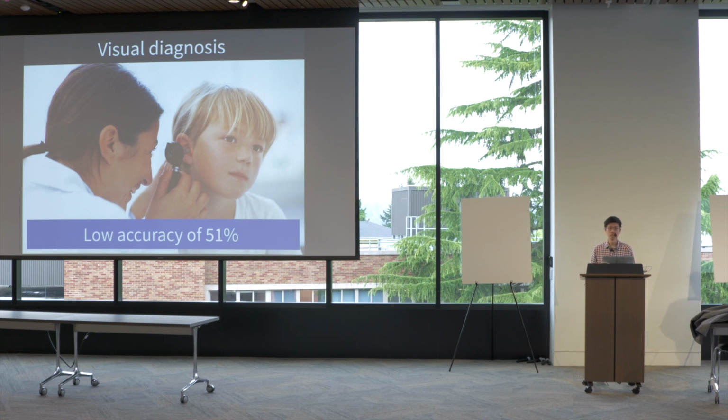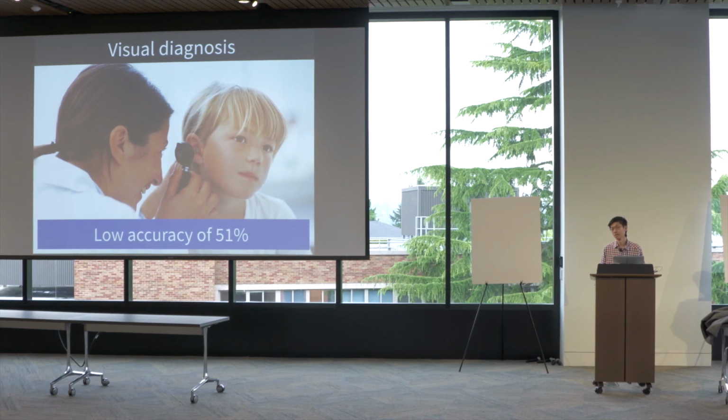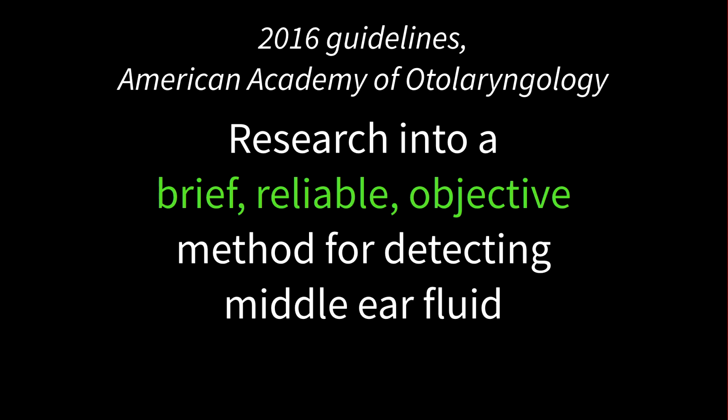Although more accurate tools exist, like pneumatic otoscopy and tympanometry, they tend to require referral to a specialist and can be pretty time-consuming. So unfortunately, today there really aren't any tools in the market that can accurately and accessibly detect middle ear fluid. As a result, the American Academy of Otolaryngology has called for research into a brief, reliable, and objective method for detecting middle ear fluid.